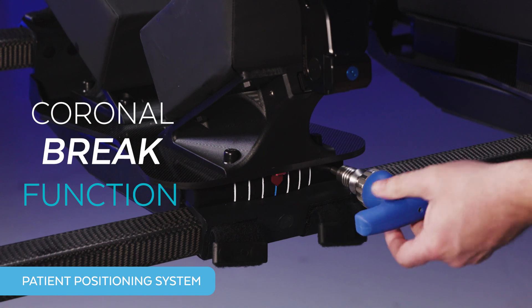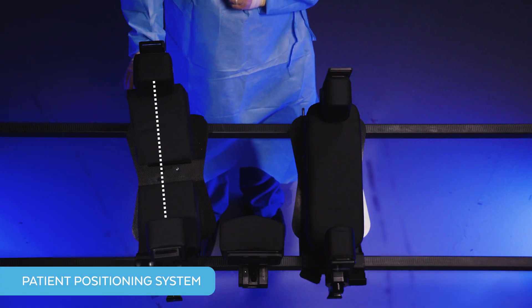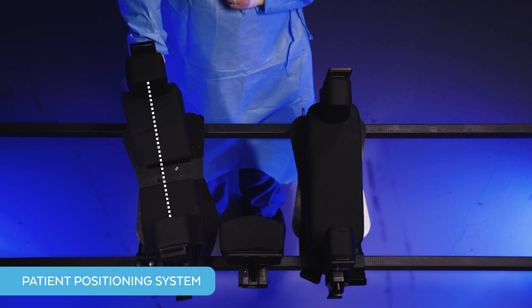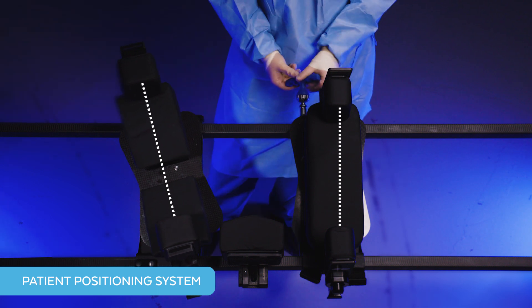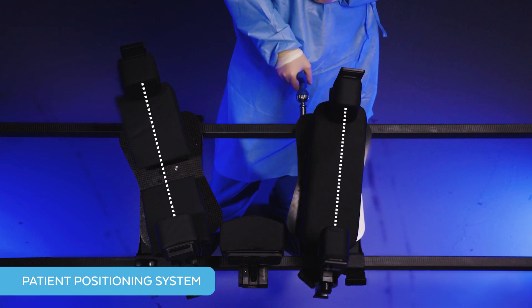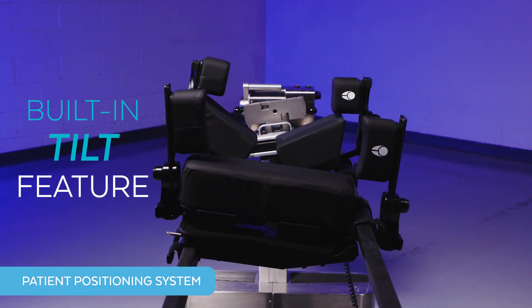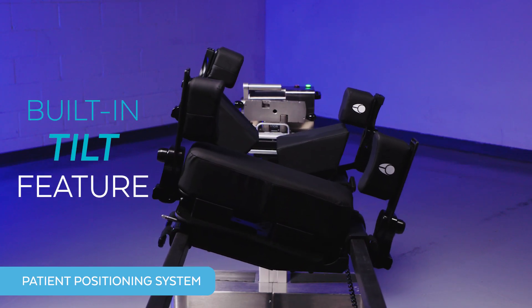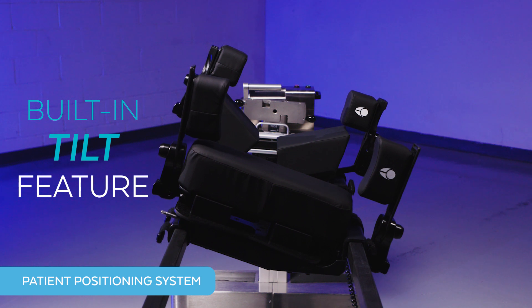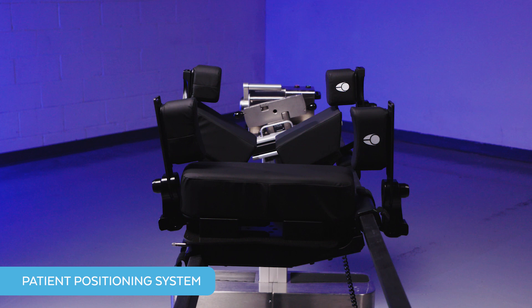Next is the coronal break function, which is a gear mechanism that is surgeon controlled. This mechanism rotates the patient's hip and chest pads independently to separate the iliac crest and the ribs, facilitating access to levels occluded by bony anatomy. Lastly, we have the built-in 15-degree tilt, a surgeon-controlled feature that increases the maximum table tilt from 25 degrees to 40 degrees, enabling better surgeon ergonomics for a more neutral and comfortable stance.